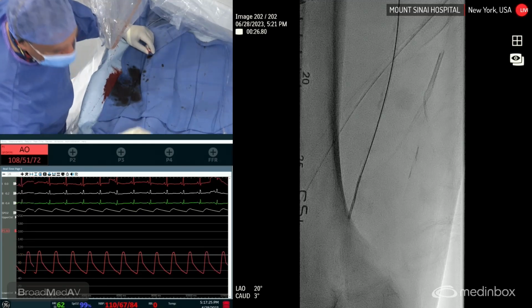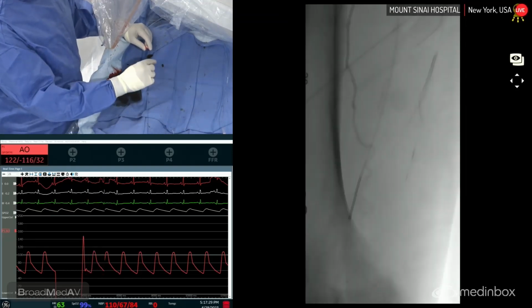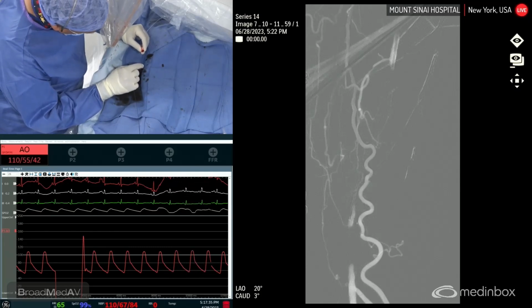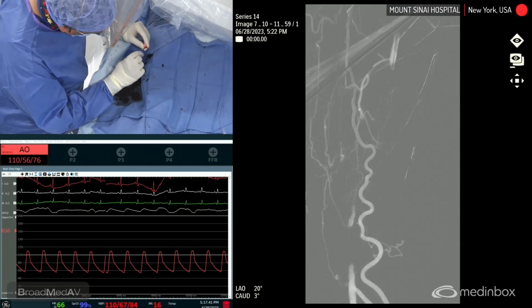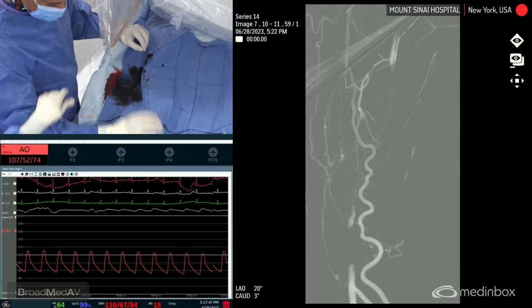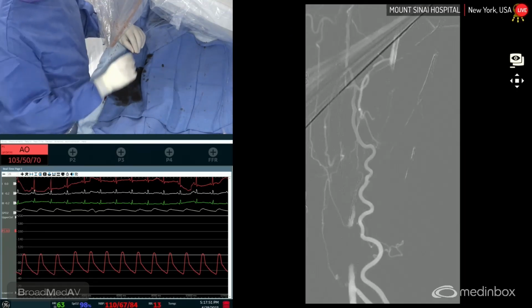You can see a very fibrotic, long-standing lesion, causing all these problems. So there's our reconstitution short segment. Should be a gimme, but it's never that way when you need it to be. So we don't have the 20? Did they give me a Connect 250T? Okay, so we may upgrade to an 018 wire if this doesn't fly through. We'll see if it does.